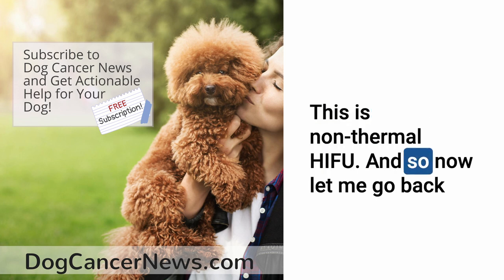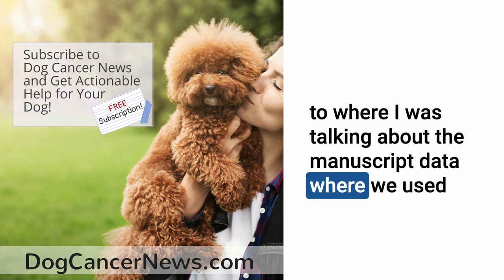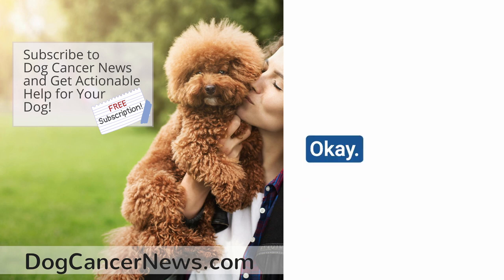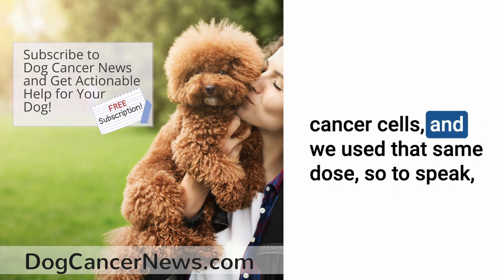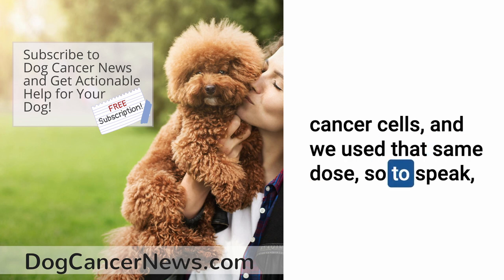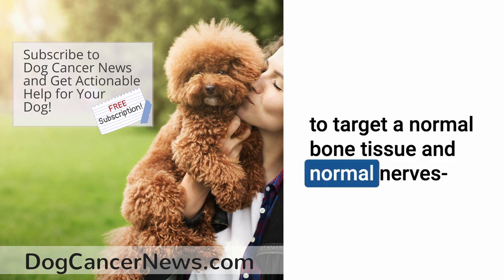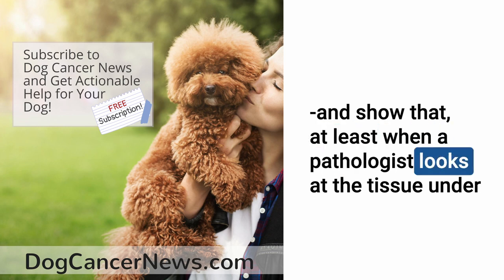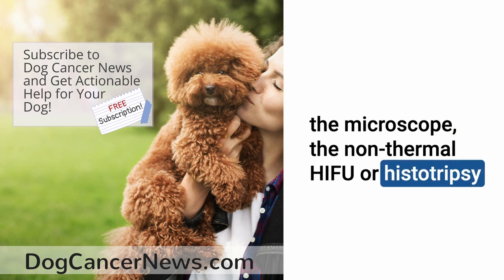So with non-thermal HIFU, also called histotripsy, we established a dose that would break down bone cancer cells. We then used that same dose to target normal bone tissue and normal nerves. And showed that when a pathologist looks at the tissue under the microscope, the non-thermal HIFU or histotripsy does not appear to damage that normal tissue.